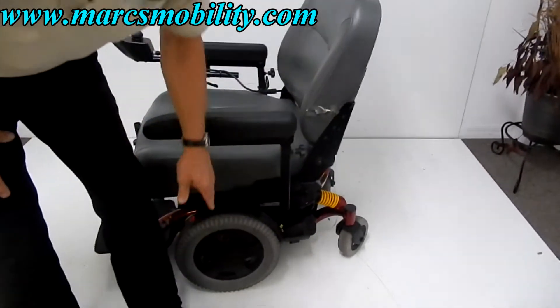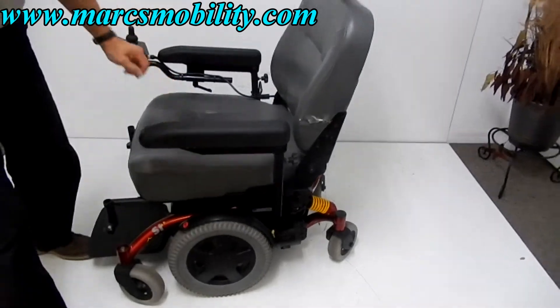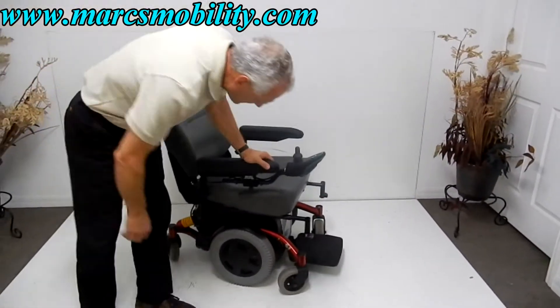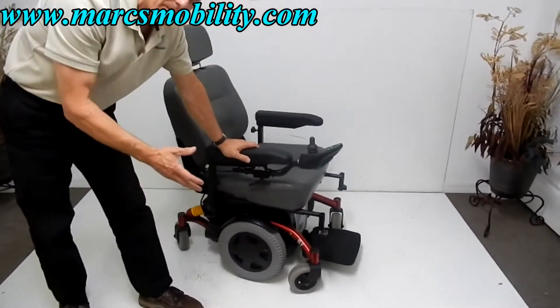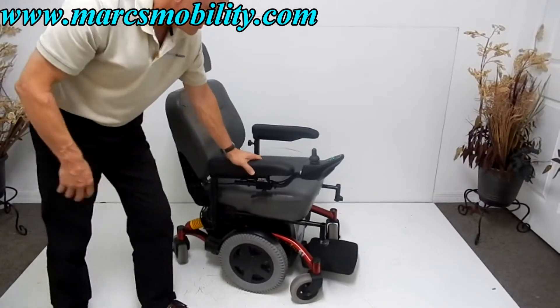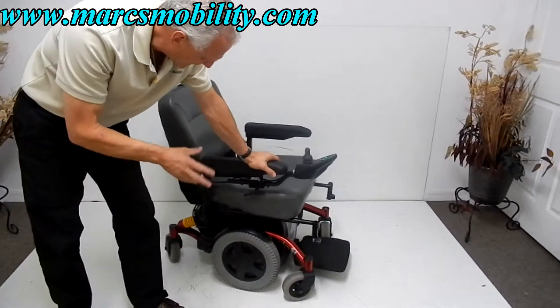There are a couple of scratches here, but the tires look new. I would get this chair if it wasn't for the gash there. By the looks of the tires and everything, it was used maybe three to six months at the most. It's a shame, but the chair itself is in excellent condition.